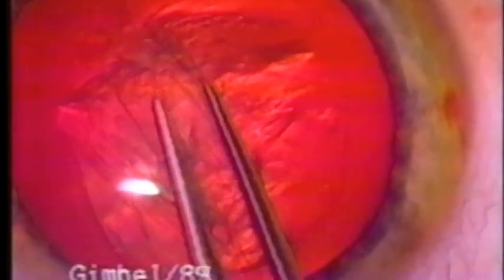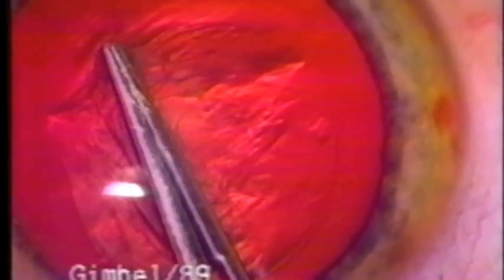So this case illustrates techniques to avoid a peripheral tear if one is aware that it is impending.